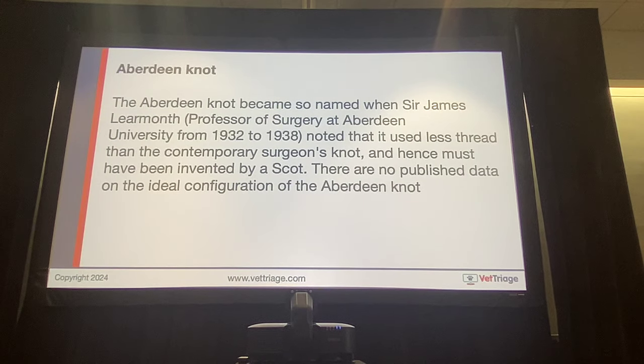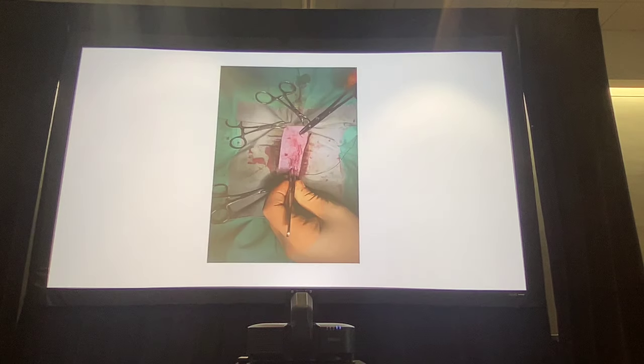It uses less suture material. Does anyone else have any other benefits, those of you who use this, why you would choose this over anything else? I know you had mentioned it buries the knot. Instead of ending with three awkward pieces of suture, where you cut the lead and have your needle driver in, it's just one. So it's much less bulky. Less suture use, less bulky knots. Maybe a little faster. It looks fast. When these guys are doing it, it seems like it's all hand ties. You're not even using instruments for it.